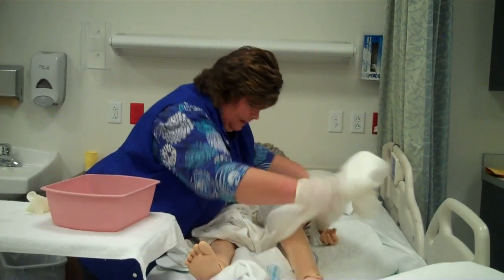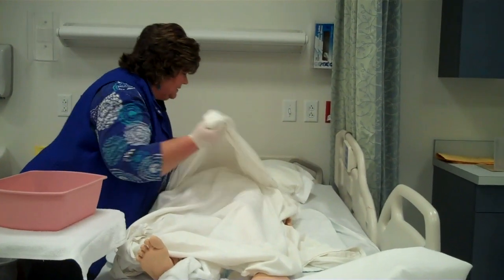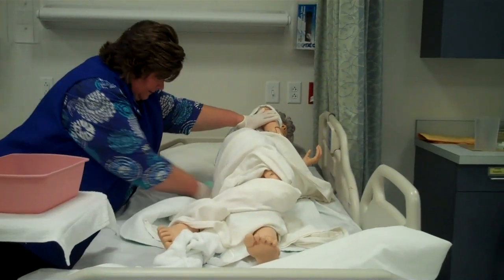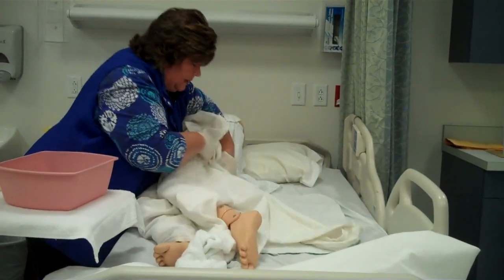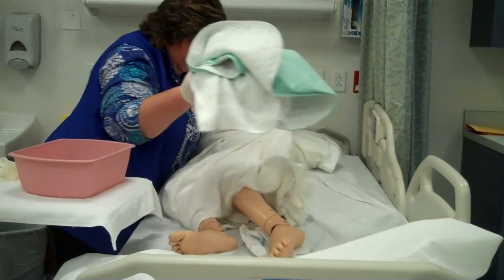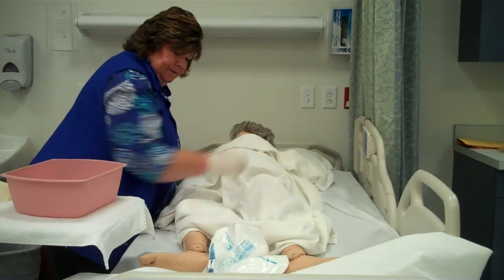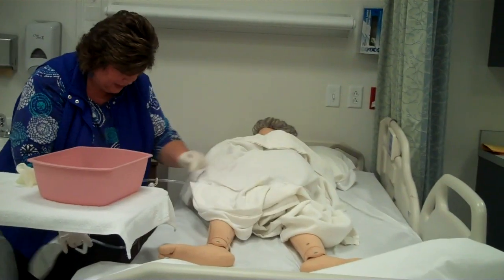I'm going to undo the bath blanket here so we can remove it easily. Mrs. Smith, if you can look at me and cross your arms once again. On the count of three, let's bend that knee. One, two, three. Let's keep you covered. Tuck this under very good, and then you can come back towards me. I'm removing the towel and the waterproof pad, putting that in my hamper. Being real careful not to pull on the drainage bag or your catheter. At this point, if I felt like my gloves were contaminated, I would change them again.